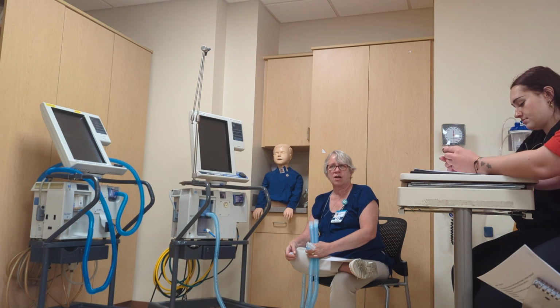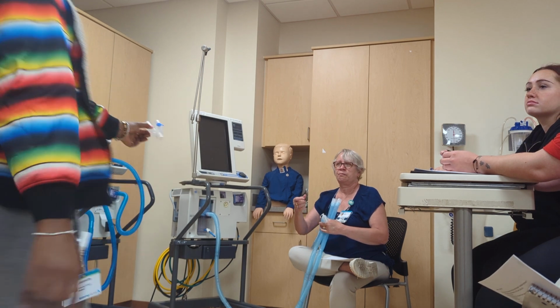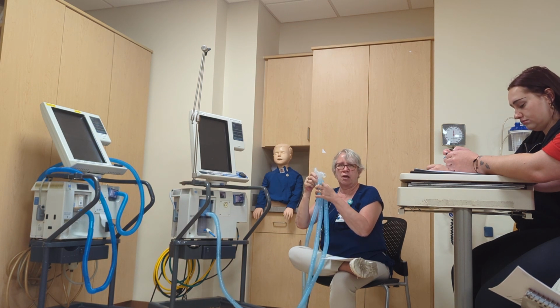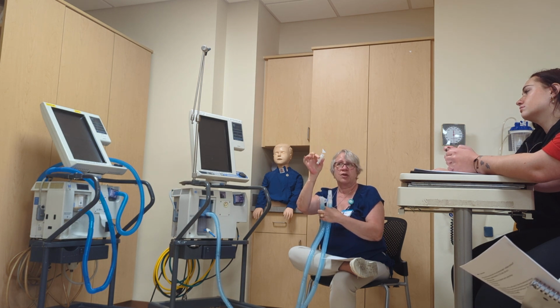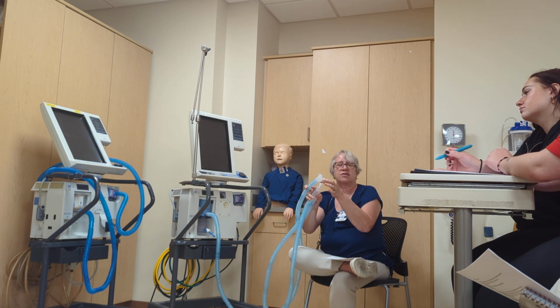That's your Y connector. Inspiratory limb, expiratory limb. Patient adapter. This is the first one I found. They might look like this. They might look different.